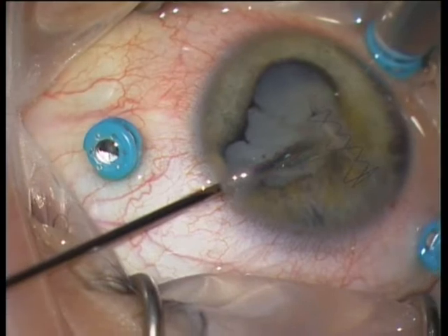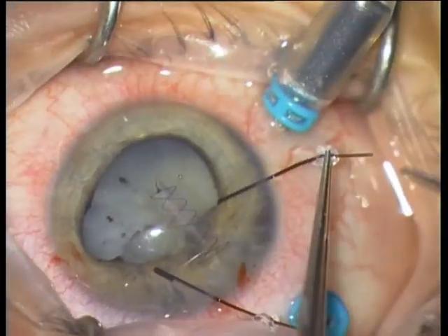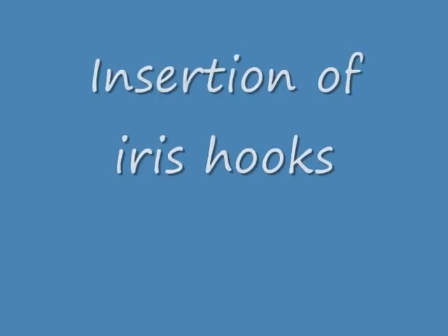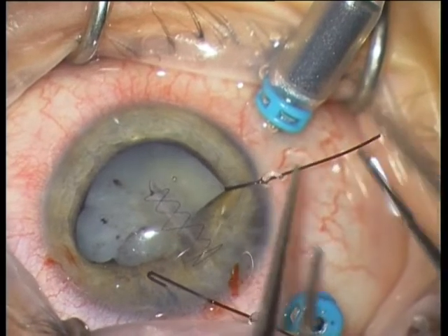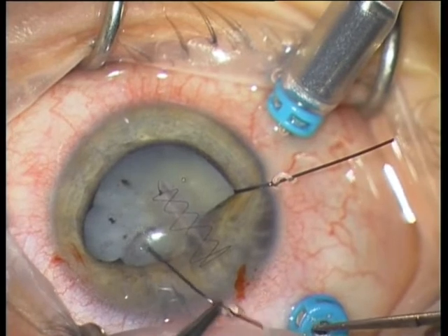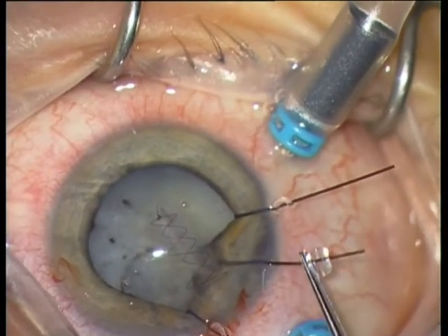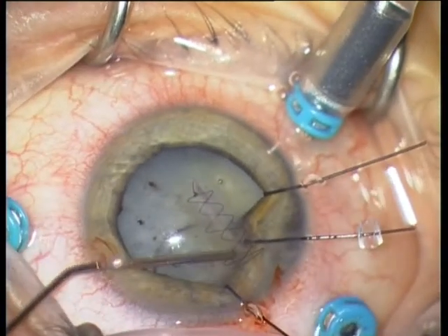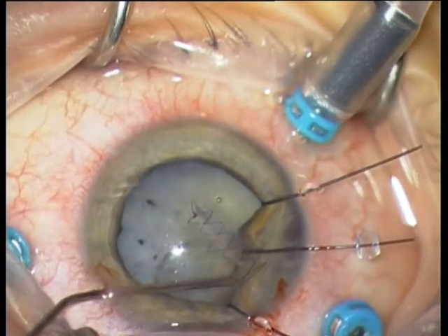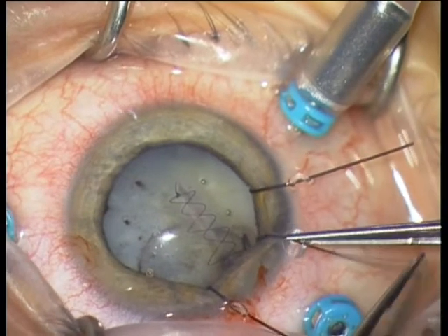There is an anterior synechiae which I am removing with the 23 gauge straight scissors from Dork. Then I am inserting iris retractors in order to dilate the pupil. The problem is that the posterior capsule is defect because the nail perforated the anterior and posterior capsule and then the retina. So you have to plan to perform an anterior vitrectomy or even full vitrectomy — that is why I inserted three trocars, to be prepared for the capsular defect.